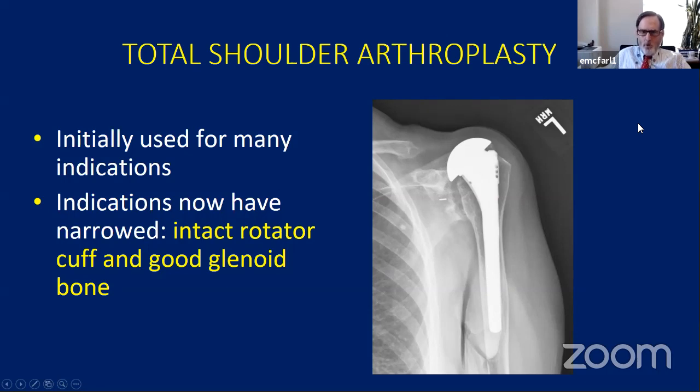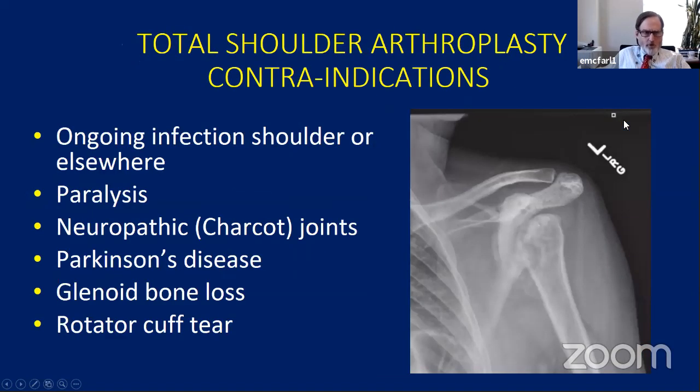And so this is what happens when the rotator cuff fails in somebody with a total shoulder. They again get this superior escape like this. The humeral head doesn't articulate with the glenoid anymore, and they sort of have the same kind of issues as a cuff tear arthropathy patient. So patients who don't have intact rotator cuffs should probably not get a total shoulder arthroplasty, and probably should go on to a reverse.